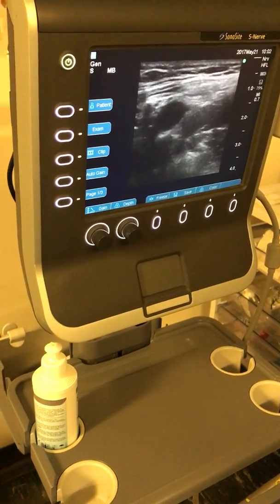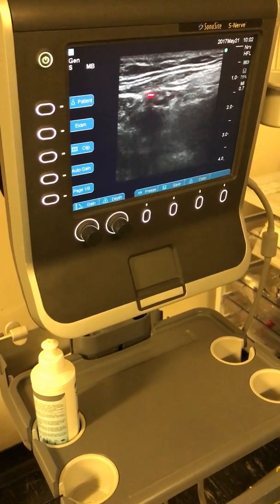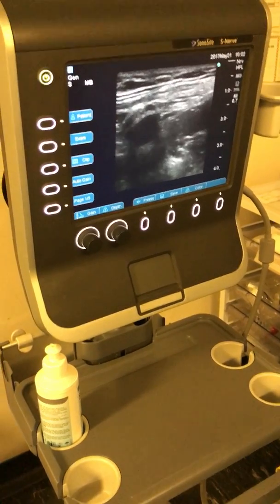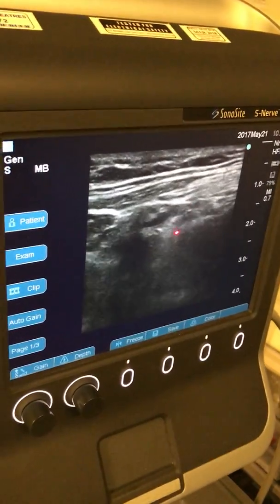If I do that, look at that, it's gone, completely gone. So you just see the femoral artery. So you go up where you start to see the nerve better. You just went up? Yeah, just went up and then turned oblique. So that's the beauty of the ultrasound. Your point of optimal visualization may not be your point of optimal blockage.